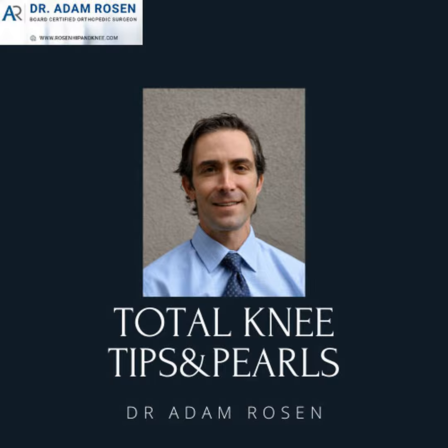The thing that I will do at this point, though, specifically in the tibia, is I will look and see, is there a cement plug, and I will work on getting that out from above. So it's really, really important at this point, so you can get your IM devices in, so you can ream and open that area up. So I will work from above and get that bone plug out and take this stuff out of the center of the tibia, but I will not go crazy on taking every little piece of cement off the femur and off the tibia at this point.